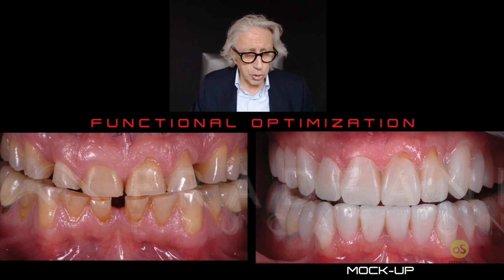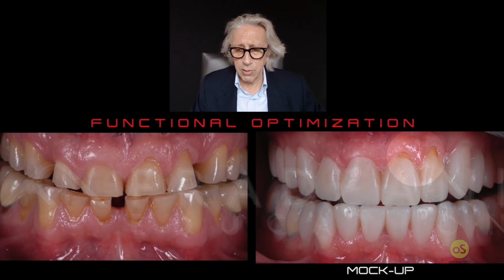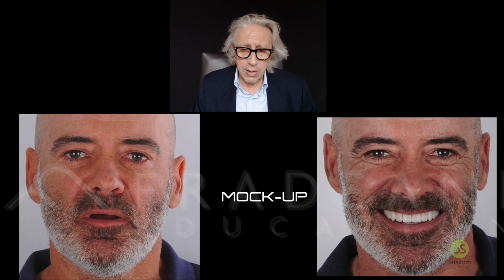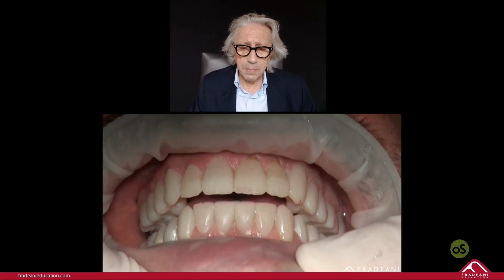Still, you see the short mock-up on the incisal area, on the cervical area, on the first central incisor, left and left lateral incisor. They were short for the reason we know, that we have a recession that you don't want to cover. So, a big difference in the smile of the patient, and a big difference also in the behavior of the patient at this point.